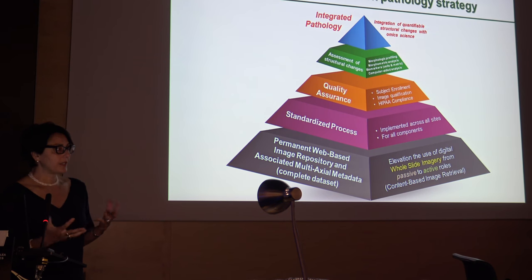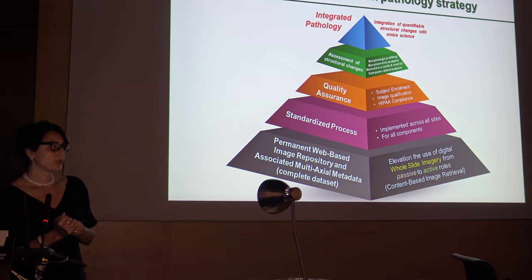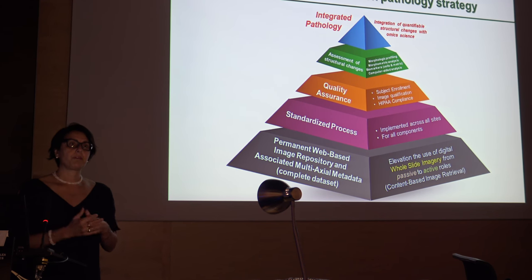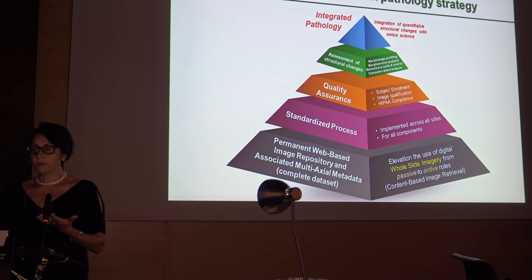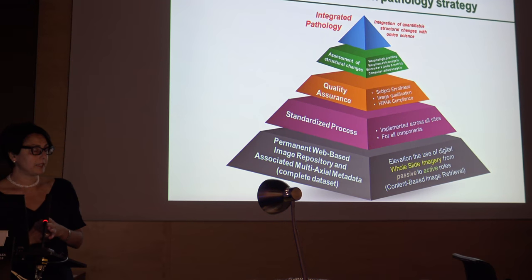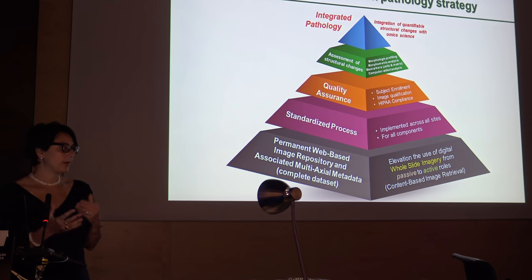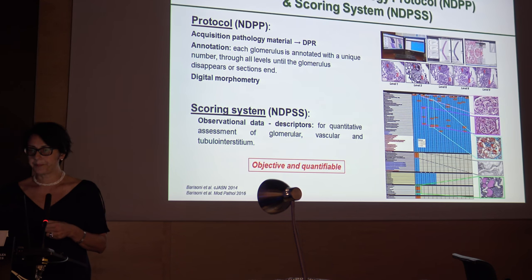When you have done all of this, now you have your basis, and you can start with your assessment of structural changes. And now, because you have a different platform, you can apply different methodologies at the same time. You can do morphologic profiling of the biopsy, morphometric profiling, use biomarker profiling, and computer-aided analysis.